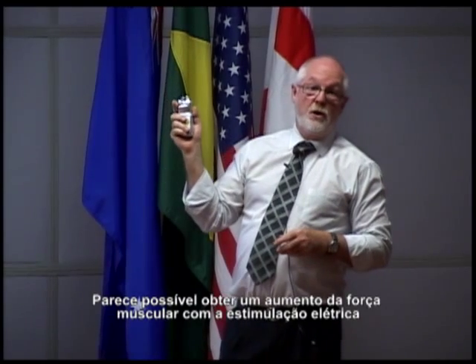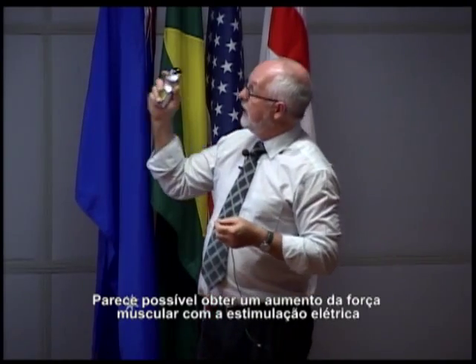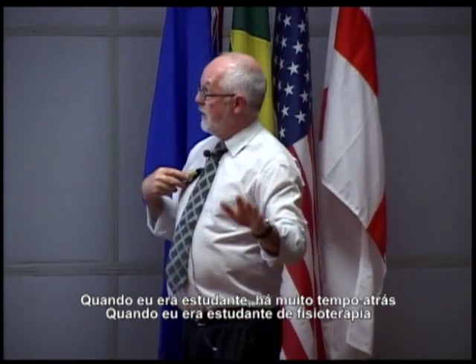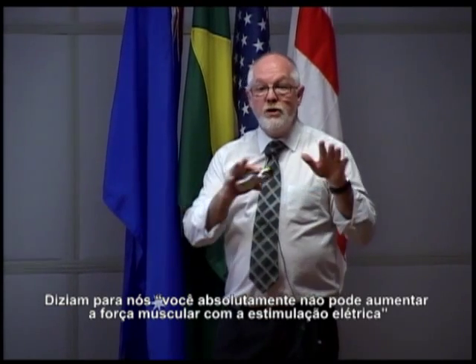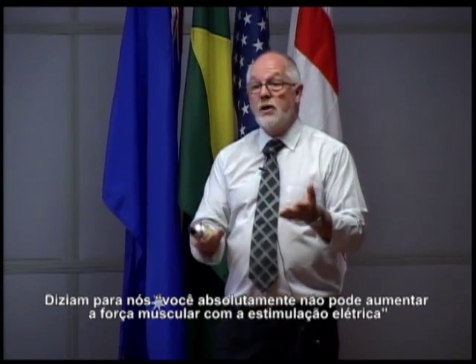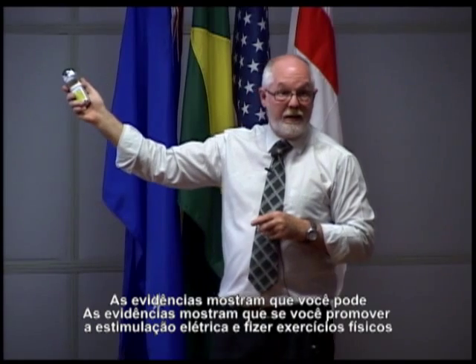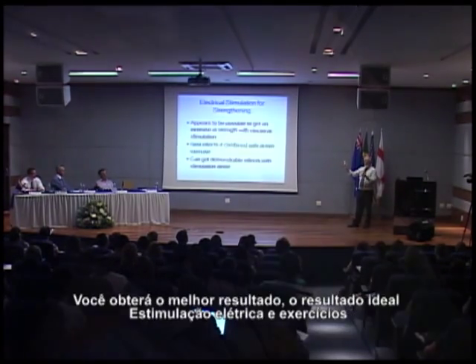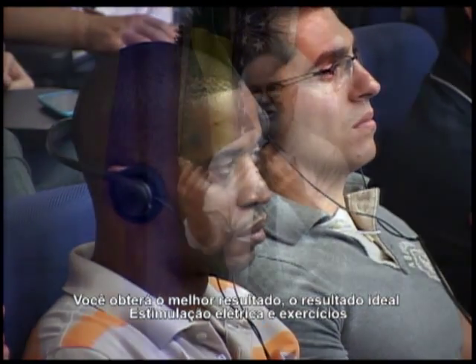It does appear to be possible to get an increase in muscle strength with electrical stimulation. When I was a physiotherapy student, a long time ago, we were told absolutely you cannot increase muscle strength with electrical stimulation. The evidence says you can. The evidence says if you do electrical stimulation and active exercise, you get the best result. The optimum result is electrical stim and exercise.